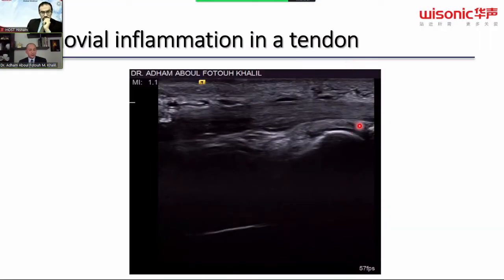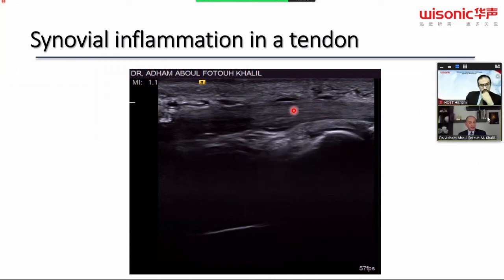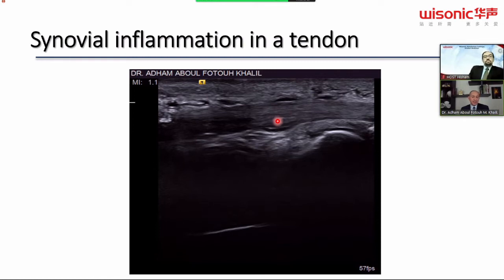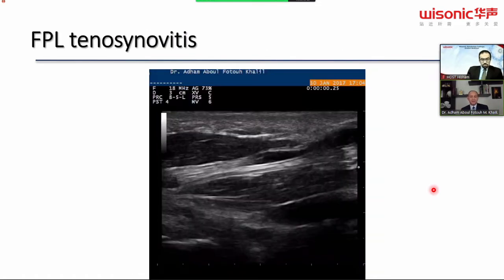You can see the distended tendon sheath and the movement of the tendon. This is very useful because this might have a differential diagnosis sometimes, where you can see triggering, where you can see tendon tear. Is it involving both tendons or one of them? Is there any tear, or is it just adhesions or synovial proliferation, or even pulley thickening that is triggering the tendon? This can be very well and quickly seen with the ultrasound.